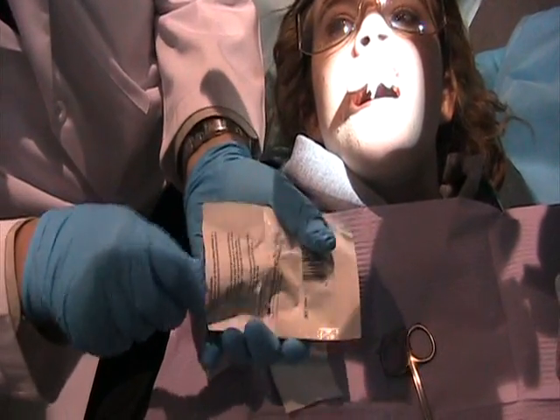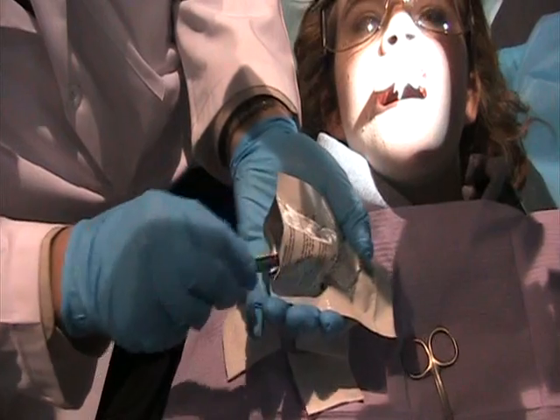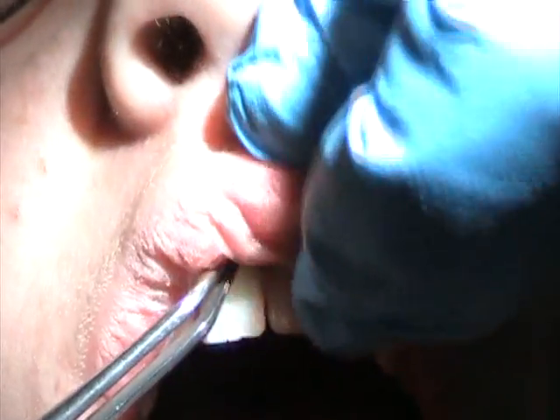Dr. Nure is putting on the Hemcon. How do you remember? And then I need a moist 2x2, please. That's a moist 2x2 he's using, right? Hold it for about one minute.